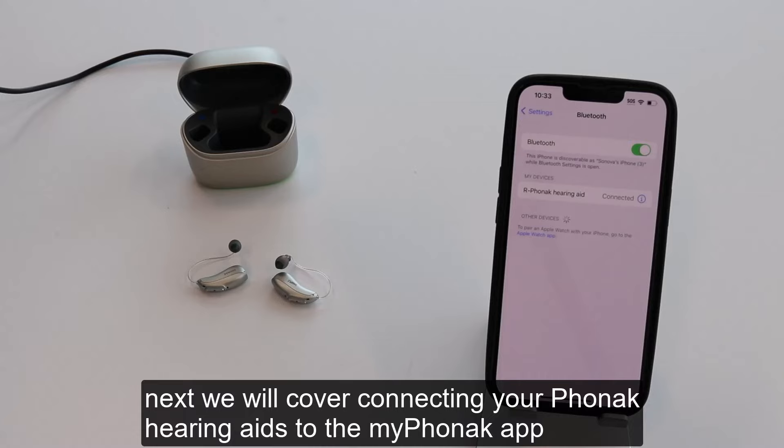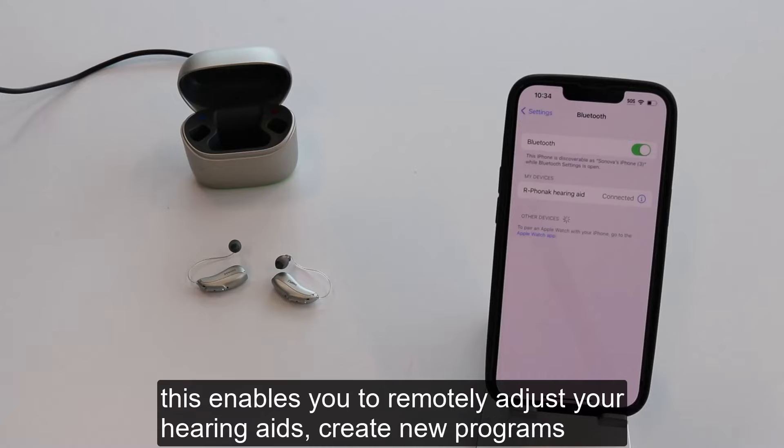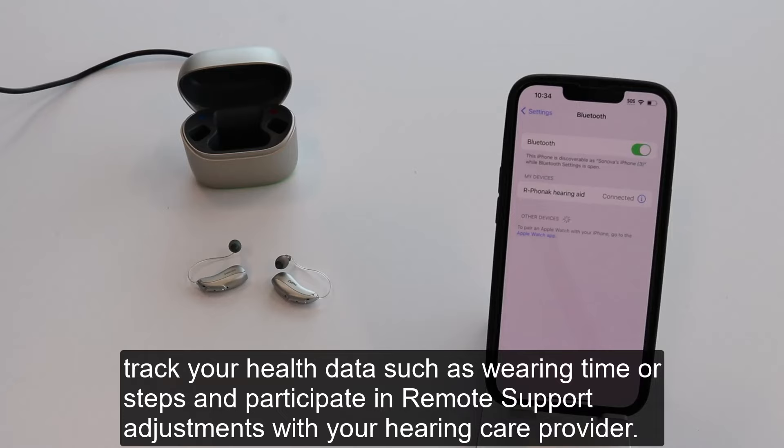Next, we will cover connecting your Phonak hearing aids to the My Phonak app. This enables you to remotely adjust your hearing aids, create new programs, track your health data such as wearing times or steps, and participate in remote support adjustments with your hearing care provider.